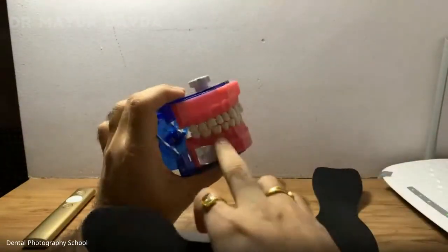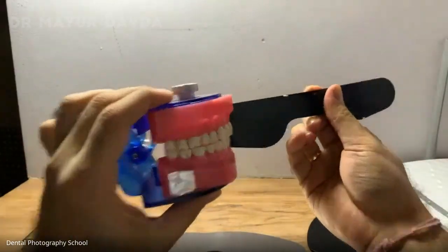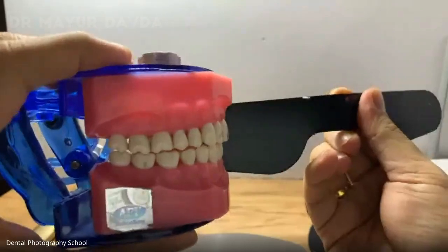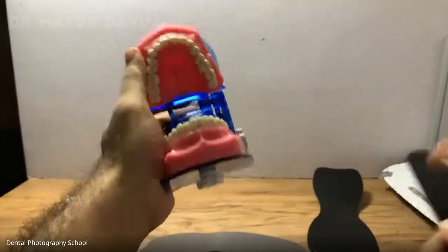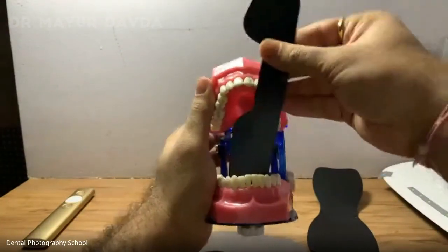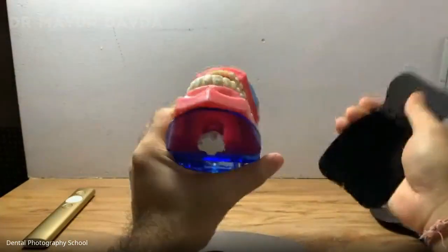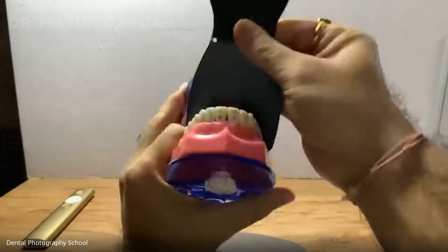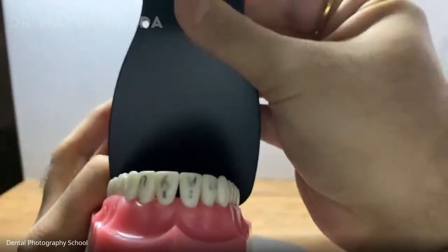All right. So if you are into orthodontics, and if you want to record molar relation of the right side of the patient, you are going to be keeping the contrastor like this, and you have to take the shot. Okay. If you are doing lower anterior aesthetic cases, you will be keeping the contrastor like this and taking the image. If you are doing upper anterior aesthetic cases on an adult, or if you are doing DSD, that's digital smile designing, you can keep the contrastor like this.